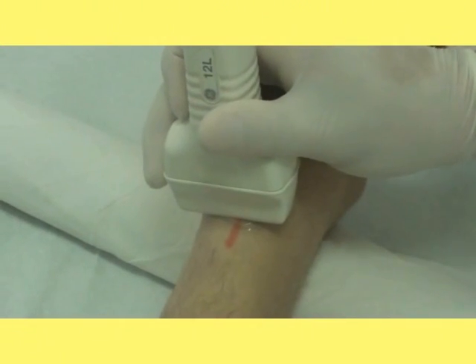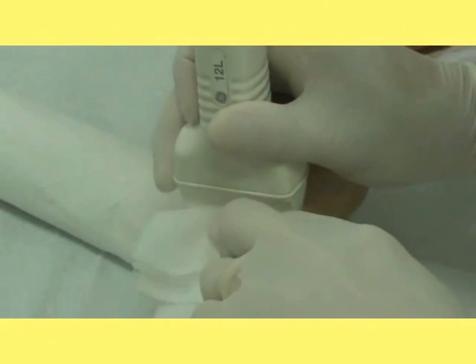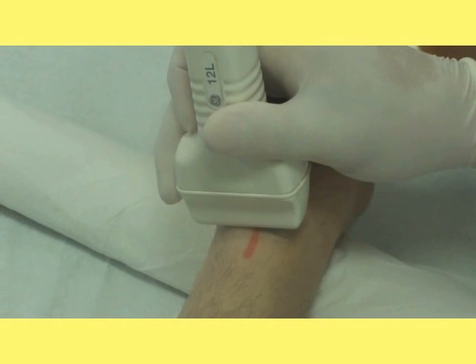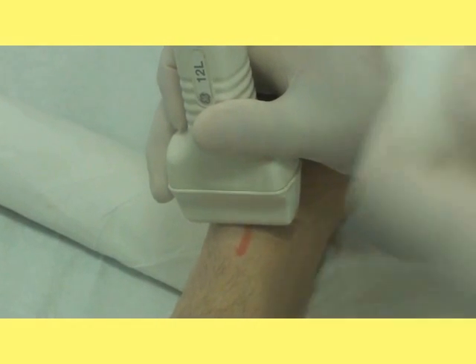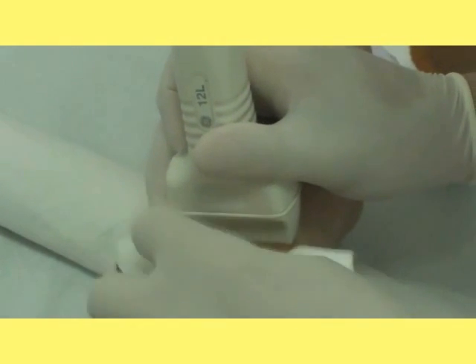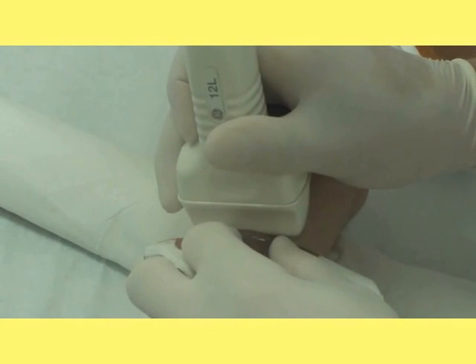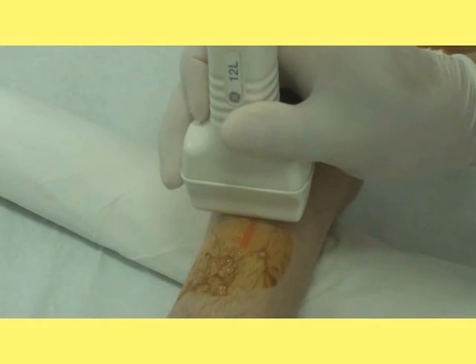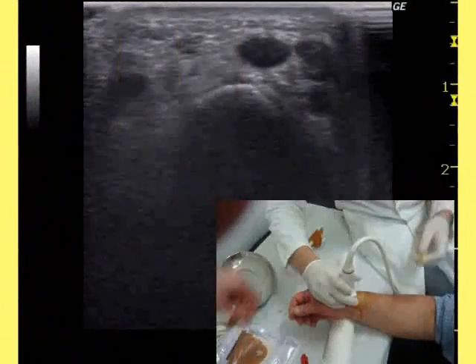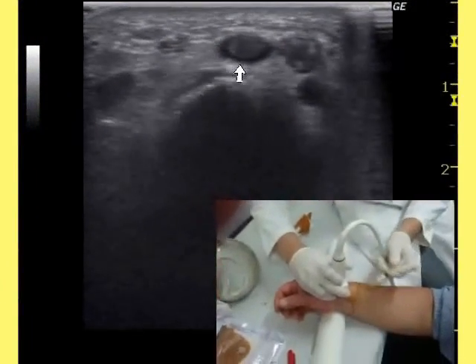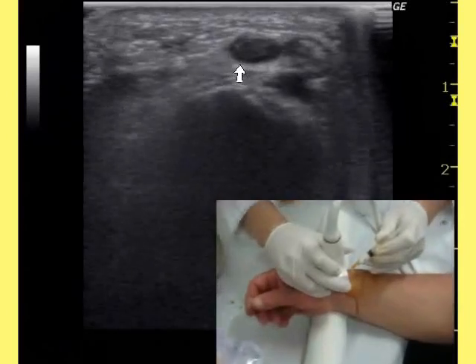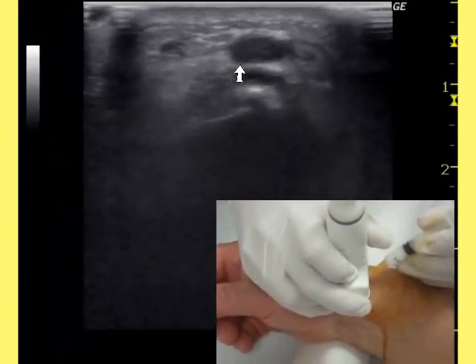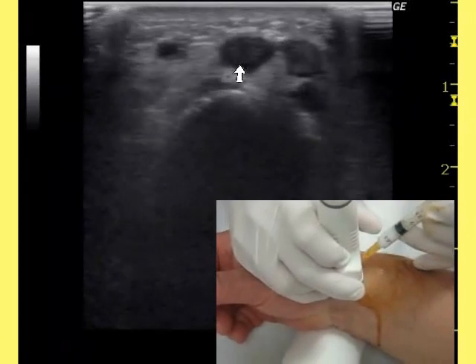The transducer is then repositioned over the tendon. After locating the injection site, the gel is removed and the skin is disinfected with an iodine-based solution with a sterile drape, so the entry point skin is sterile. The needle is placed on the previously marked line perpendicularly to the transducer and moved forward until its tip is visualized within the tendon sheath.